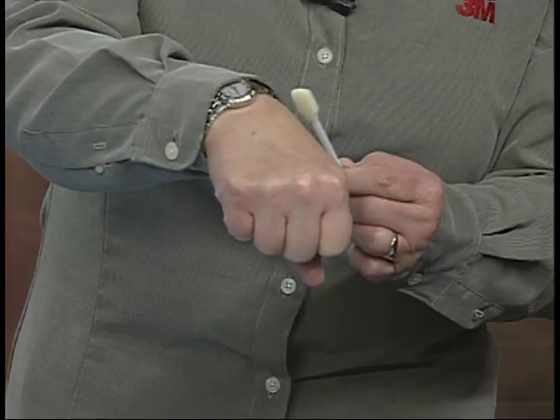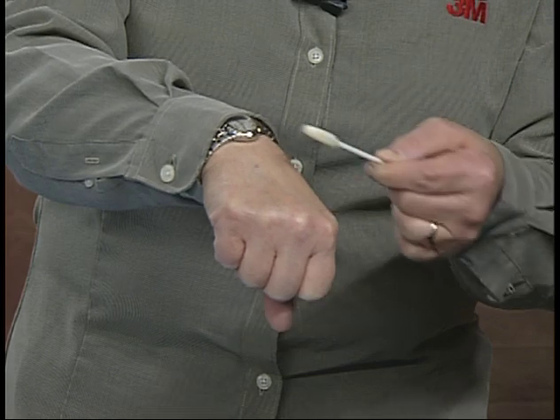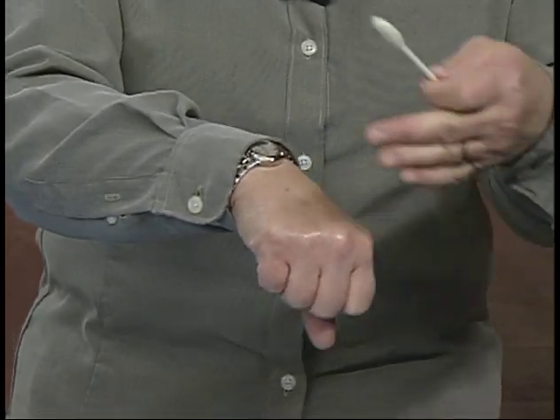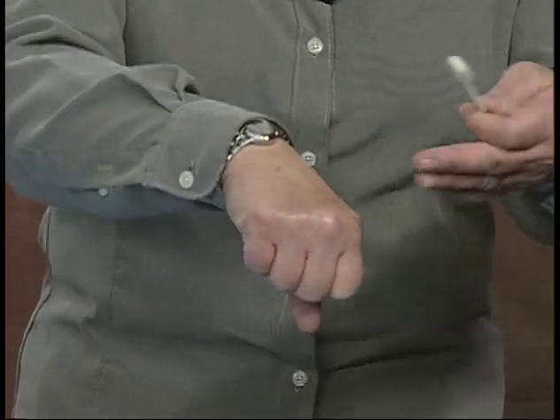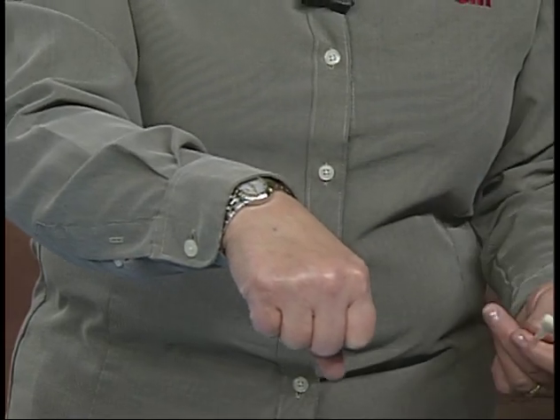It's very similar when you're using the three milliliter wand applicator. Again, paint it on in nice, even strokes, and the reason you do that is for optimal, fast drying, so you get a nice, non-sticky finish. What you don't want to do is move back and forth, applying wet film over wet film.